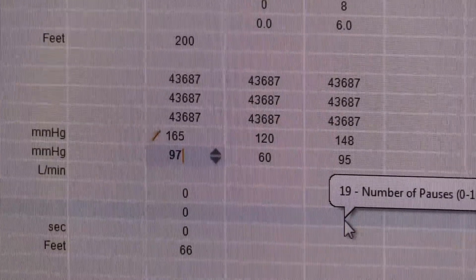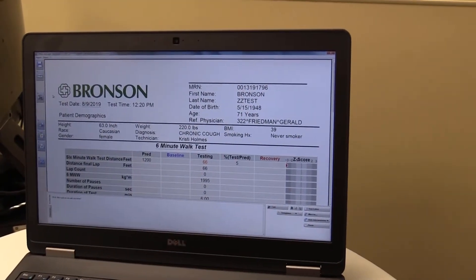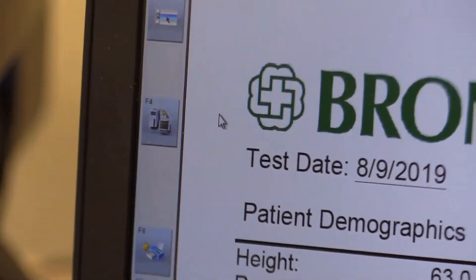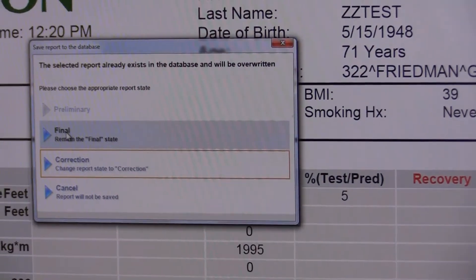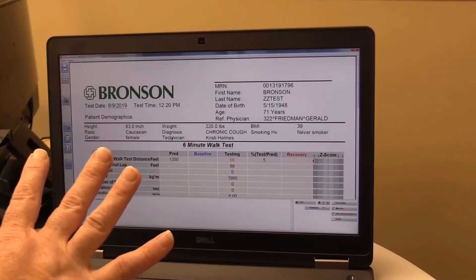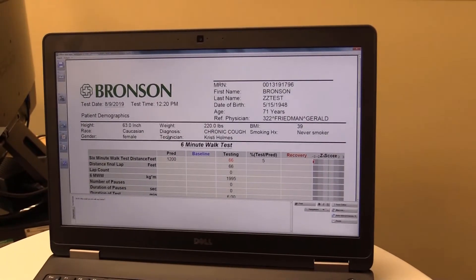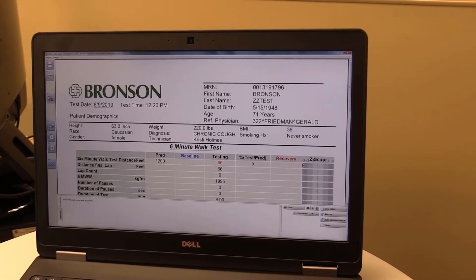Looks good. After I save my changes, I'm going to go to the Bronson six-minute walk test report and click on that. It's going to save my changes, update my report, and send it into Epic. I'm going to click the F4 icon, and it's going to ask me if I want to do a preliminary, final, or corrected copy. I'm going to say final because this does not have to be interpreted. So it's sending the final report into Epic. I can also go into Epic and pull up the patient under the MRN number to ensure that this test has gotten into Epic and that all the data has transferred correctly.